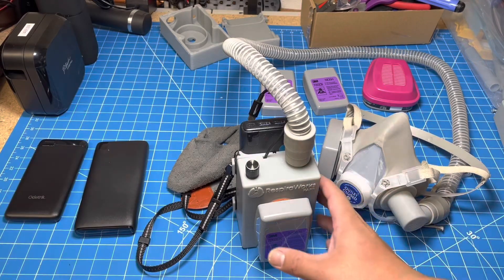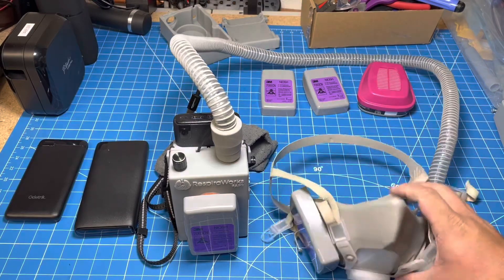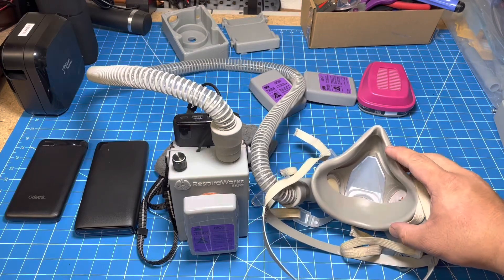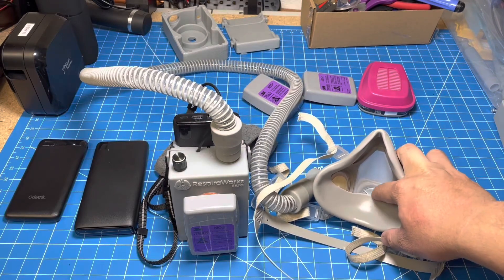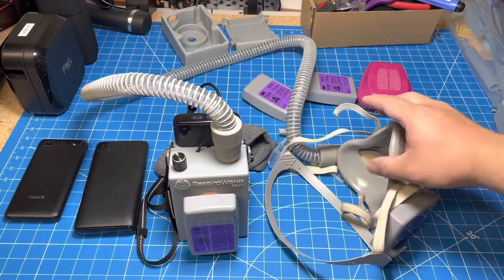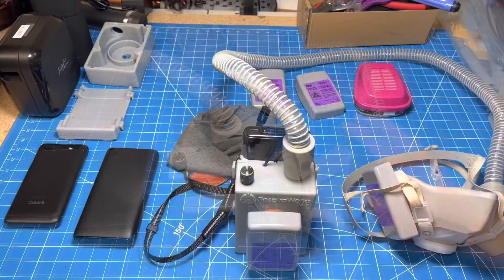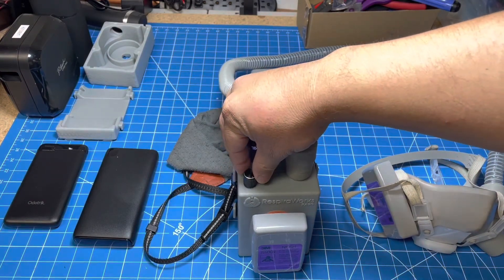We've also designed a custom-modified respirator. This is a dust respirator mask, and the nice thing about these is that they have this elastomeric silicone seal here, which gives you a much better seal than a lot of face masks — certainly better than a cloth mask — to give you better protection. We've modified this with an outlet seal, so the exhaled air is instead directed through another filter cartridge. Both the inhaled and the exhaled air go through the same filtration, so this is a system that protects not just the wearer, but also others around the wearer.